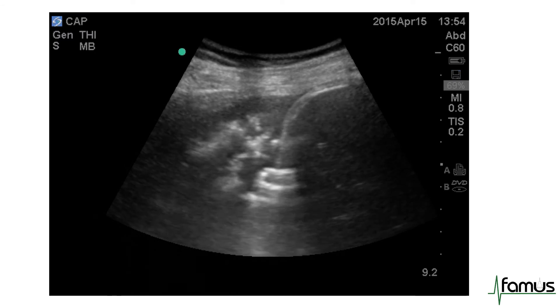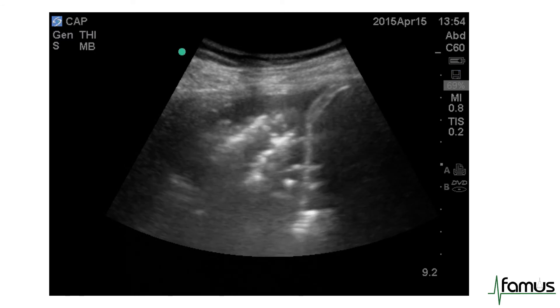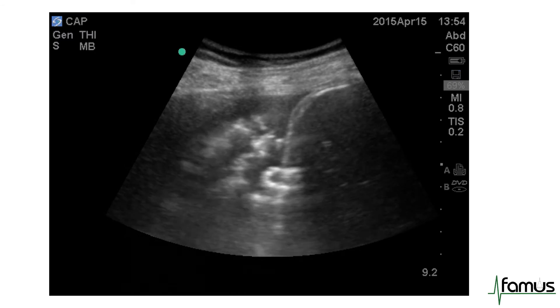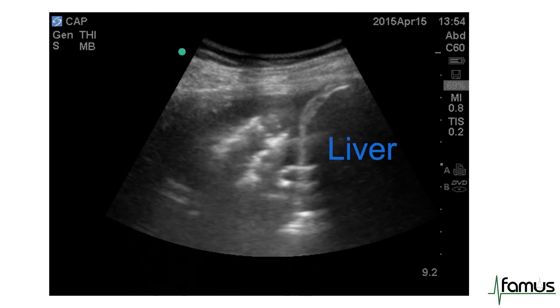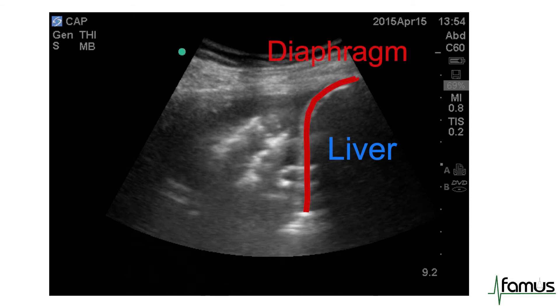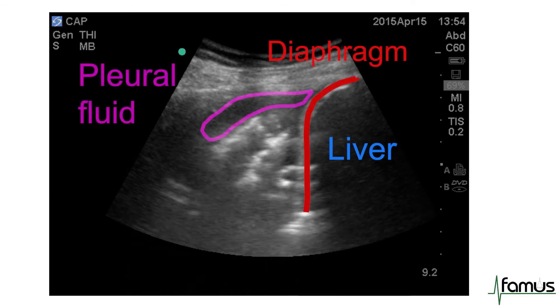And finally, another example of the shred sign, with a liver and a diaphragm on the right-hand side and a small amount of pleural fluid.